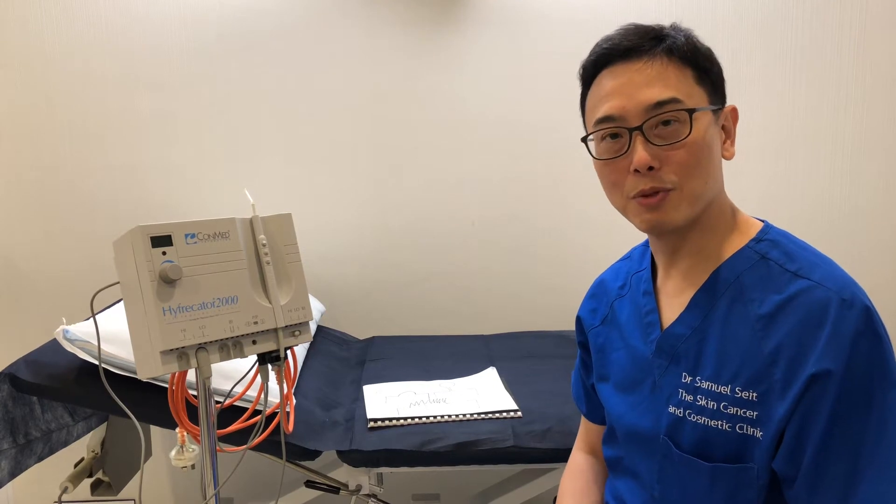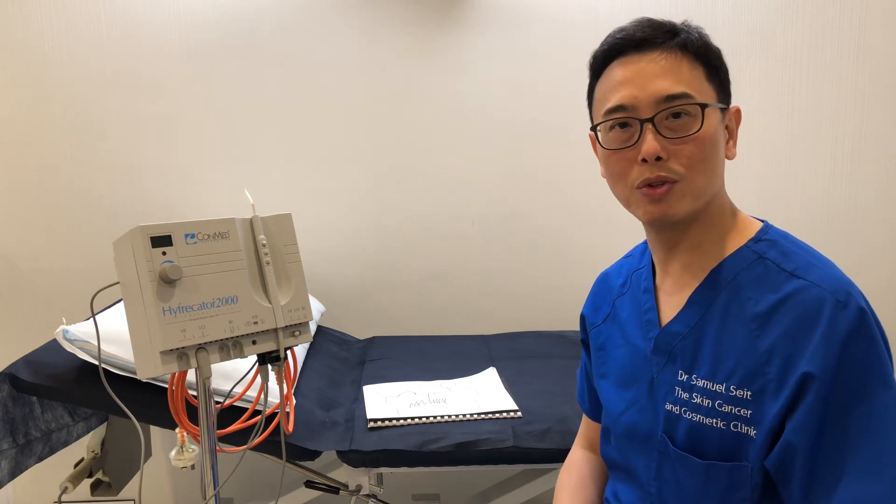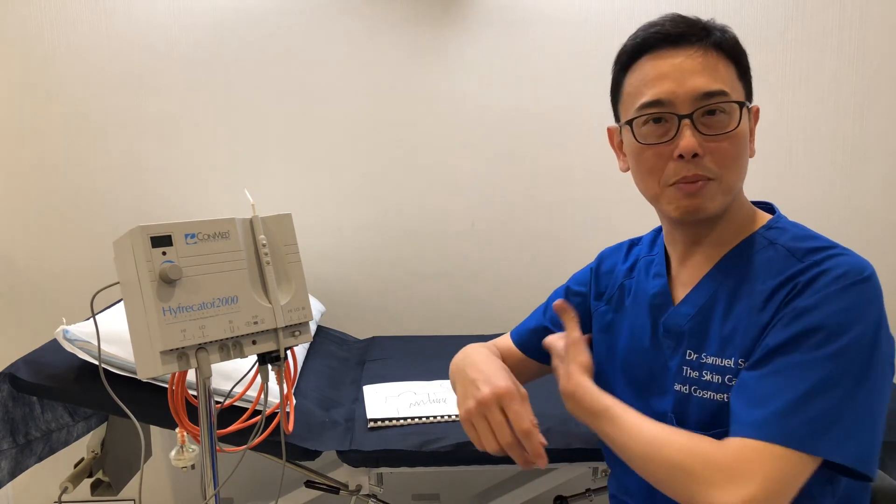Hi, Dr. Sam Nussit from Skin Cancer and Cosmetic Clinic in Neutral Bay. I'm here to tell you about the ConMed Hyfrecator, or electrosurgery. This is a very nice, efficient method to remove multiple raised moles, aging warts, or unwanted skin tags that you may find annoying on your body or your armpits.